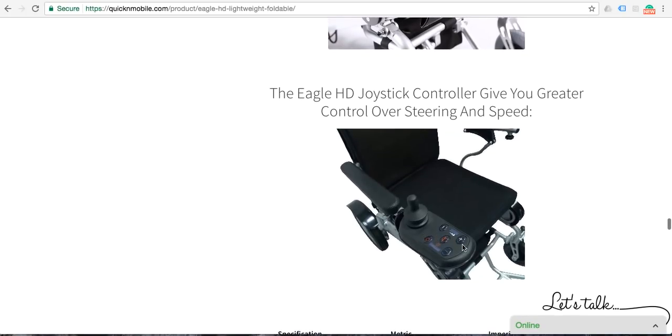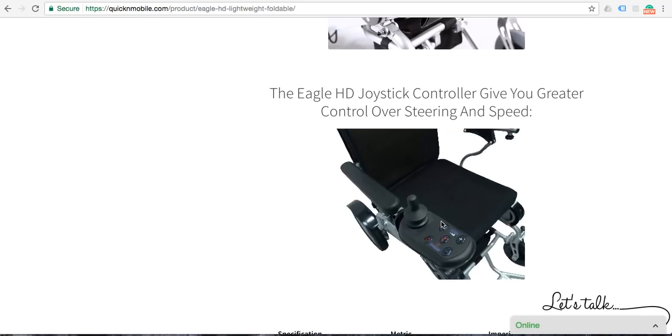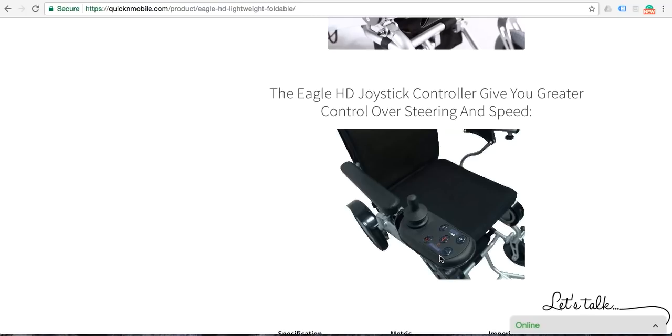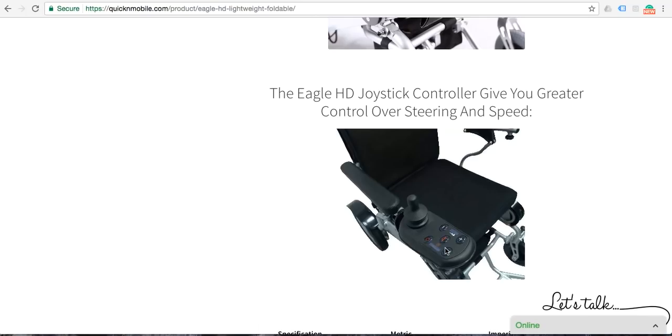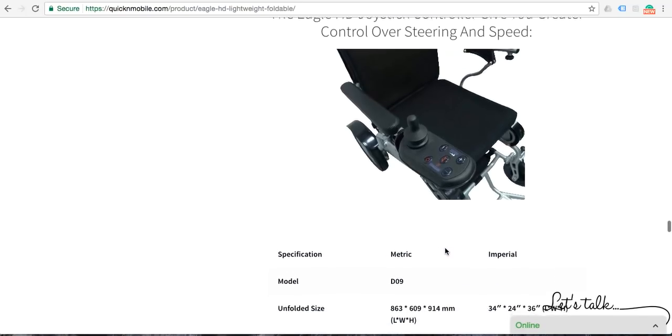The joystick is very simple to operate. It comes with a horn, it comes with the easy ability to increase the speed with the click of a plus button or to decrease the speed, and you have multiple settings for speed. You have a clear indication of how much battery you have left. You have the off button which is the slight red circle and then you have the on button which powers the chair on or off through the joystick. So literally it is a snap to work with. With a couple of pushes of a button, the Eagle is on and the Eagle is ready to take off.